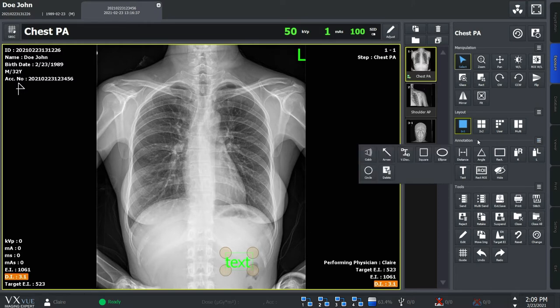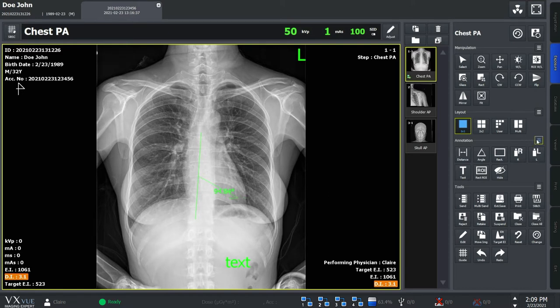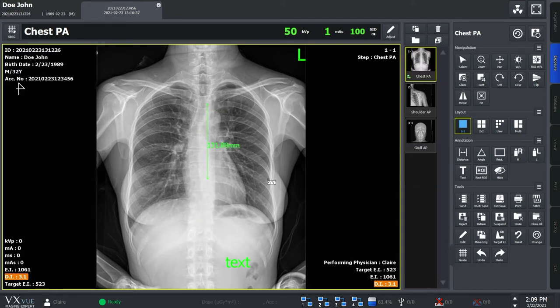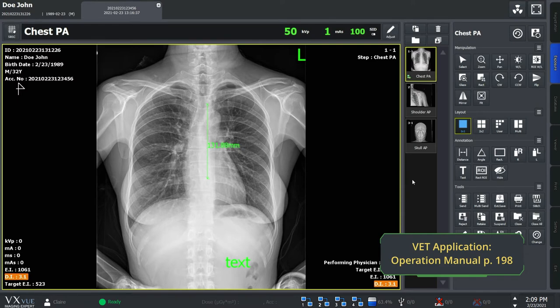Aside from the basic annotation tools, we have more advanced functions like calculating the cop angle and vertical discrepancy. Please note that we have more tools prepared for VET applications. You can learn more about our functions from our operation manual.